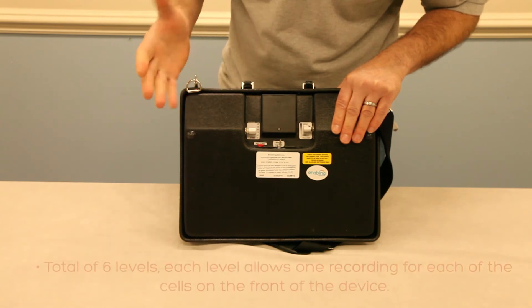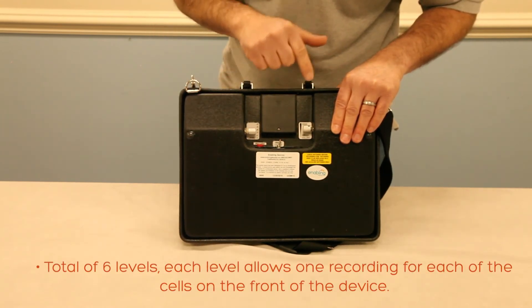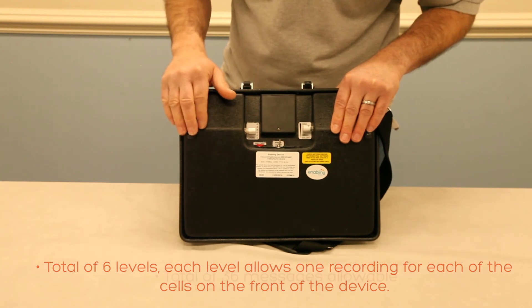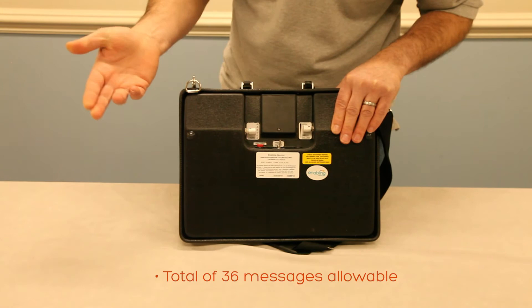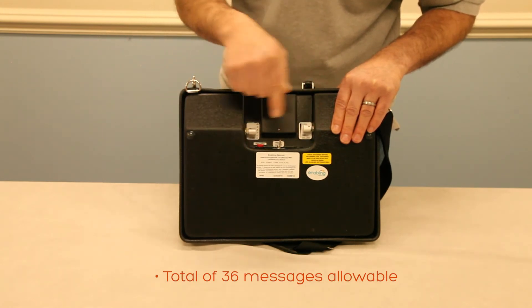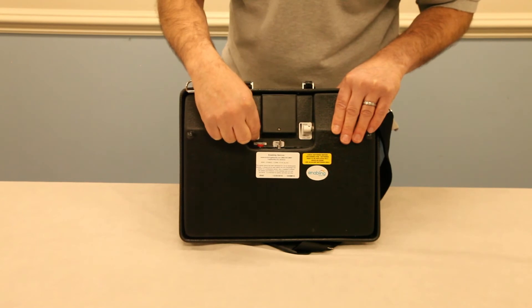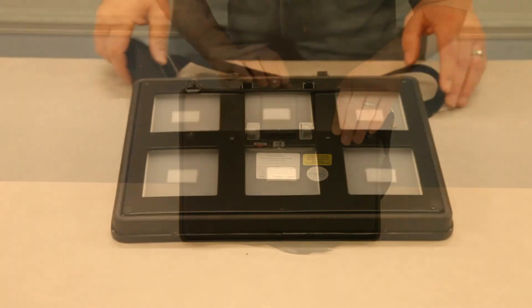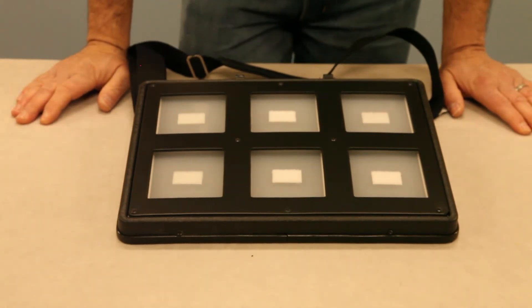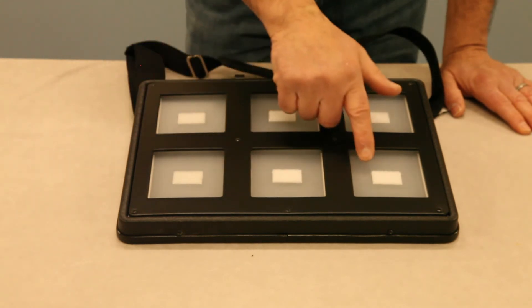A little more information about the levels: each level allows you to record a message for each one of the cells on the front and retain them. When you switch to the next level — for example, level two — you can record another message for each cell. This allows you to record and retain up to 36 messages in total.